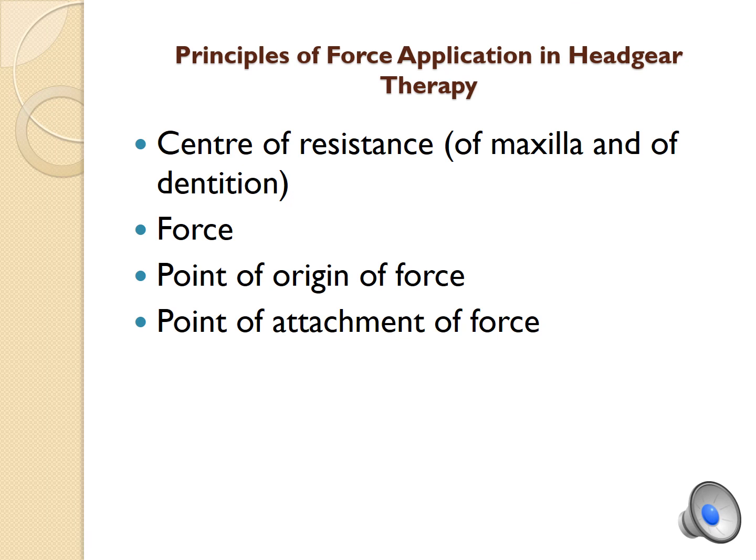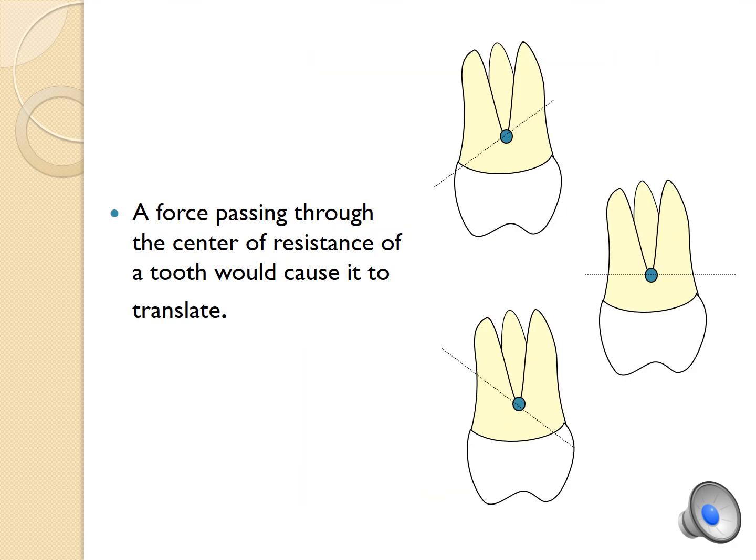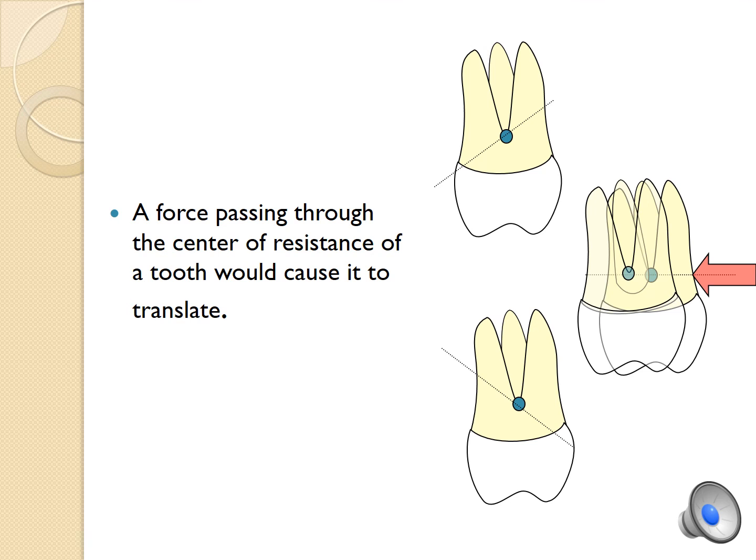Principle of force application in headgear therapy. Now I will explain one by one the center of resistance, the force, the point of origin of force, and the point of attachment of force. Center of resistance is the point through which the resultant of the forces acting upon a body will produce a translatory movement. A force passing through the center of resistance of a tooth will cause it to translate, or move. Once we have a force passing through the center of resistance, the tooth will move.